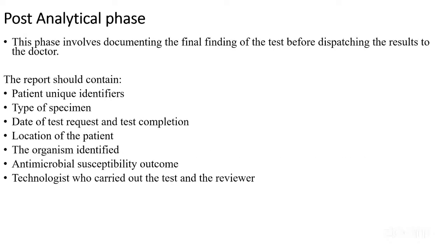So the post-analytical phase is a phase where you have already done your urine collection, you have analyzed in the lab, you are done with your cultures, you've recorded all your findings. Now here you are coming to do the final report so that it can be dispatched to the doctor. You should be able to have a final report that is complete with the patient unique identifiers. It should have the type of specimen that was used, the date the test was requested, and the date it was completed. You should be able to know which location the patient is in.